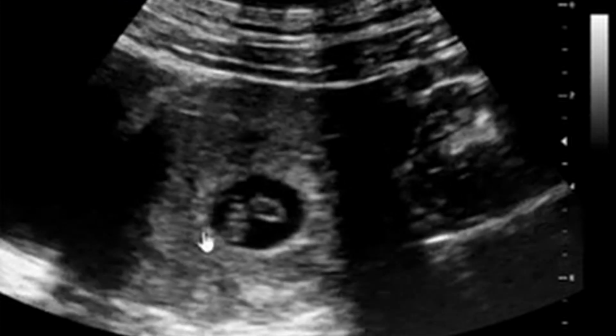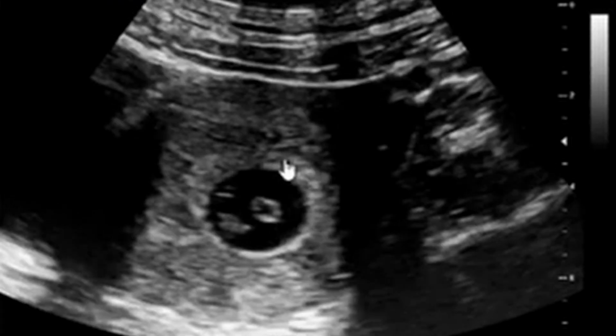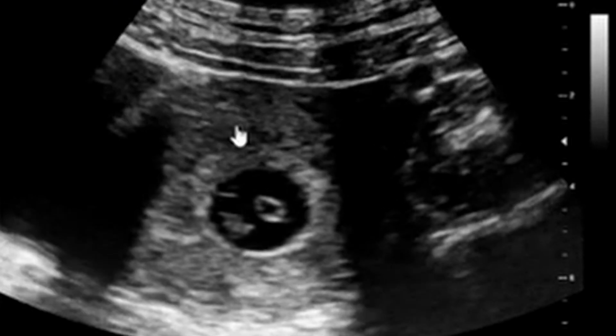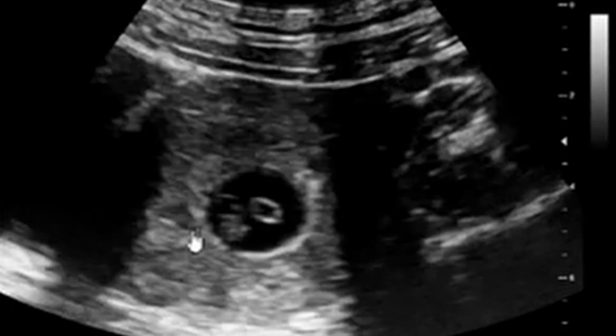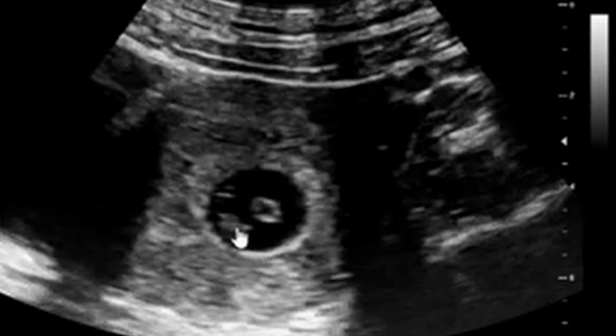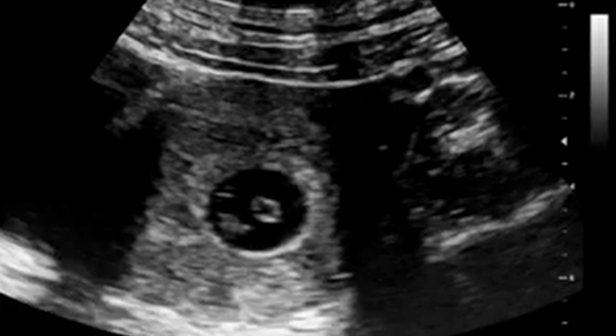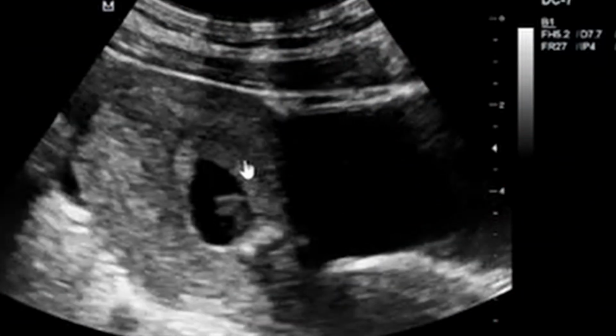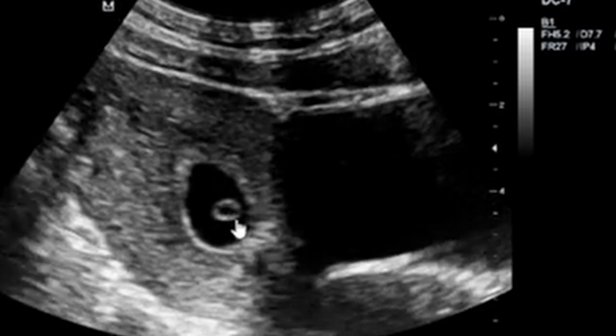So we have got our thick-walled gestational sac here, double decidual sign, and you can appreciate the uterus, a nice uterus that we have. So this is a nice intrauterine pregnancy, it's not an ectopic pregnancy, and you can see it's actually a viable fetus, as I've said before. Again, you can appreciate here the urinary bladder, the cervix, and we've got our nice yolk sac here. So it's a nice cystic space.